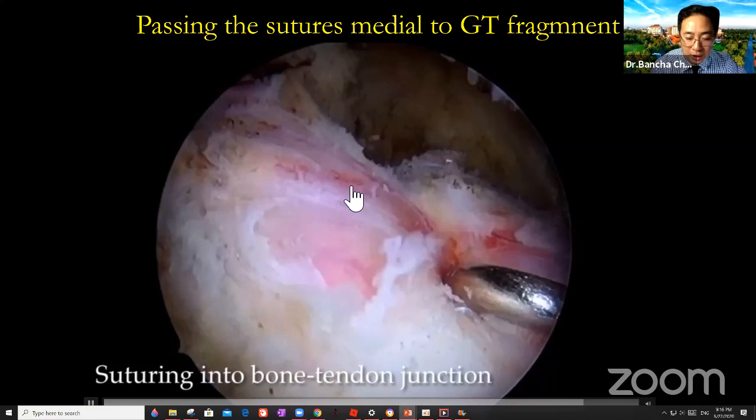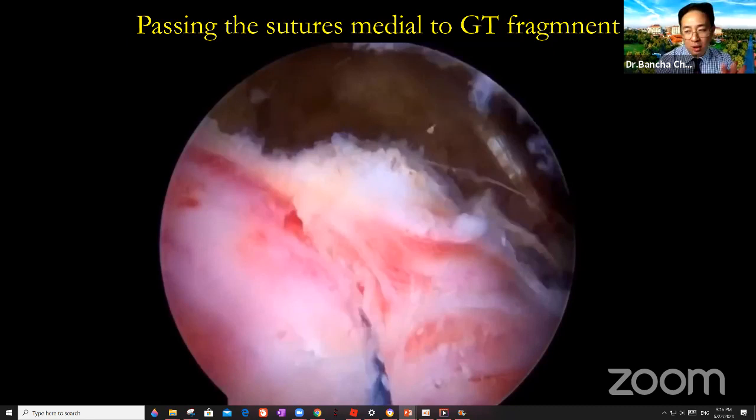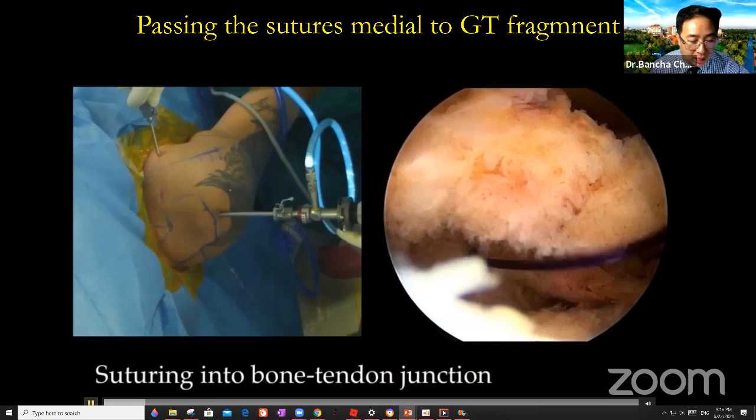So I plan to use triple load anchors. I have 12 sutures, but I put only six holes. One hole, I have two sutures. So I will not have too many sutures in the cuff, but I have more sutures. These sutures will distribute over a wider area, and we have better contact.